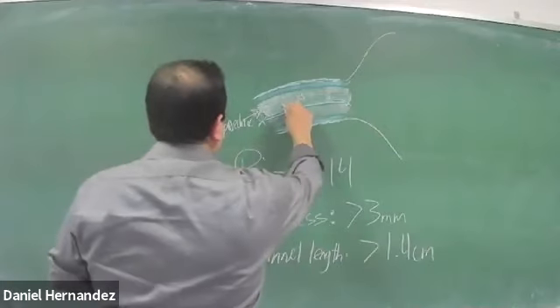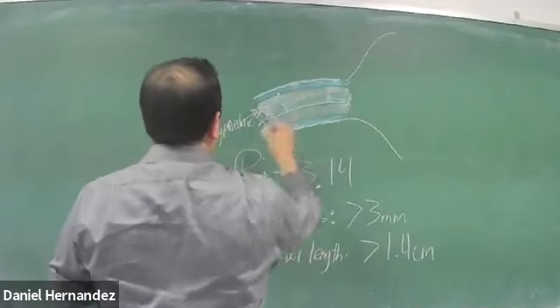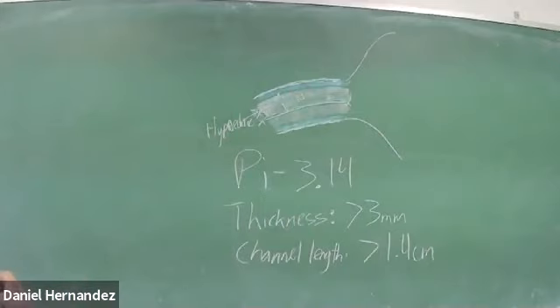So measure the thick hypoechoic layer in between.